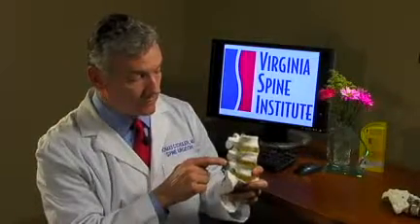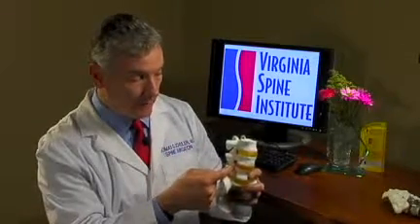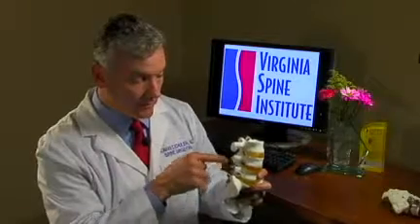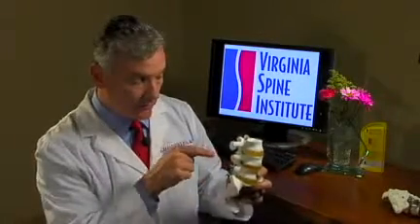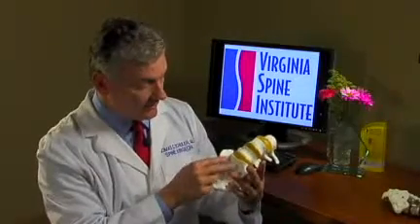These pedicle screws are actual screws that go into the bone through the pedicle — the pedicle being the area between the vertebral body and the posterior structures. The screw actually screws into that small area and then down into the vertebral body, where it is anchored.